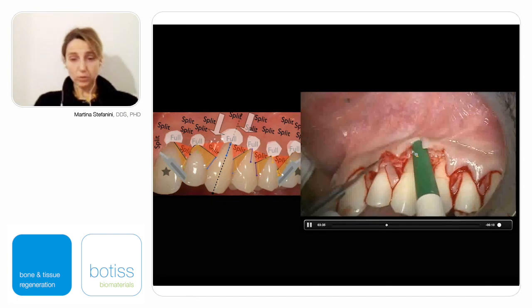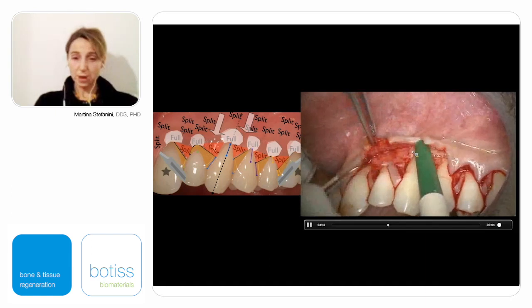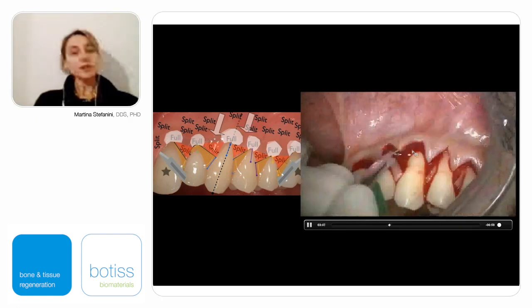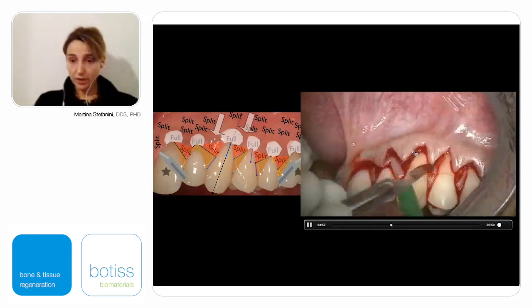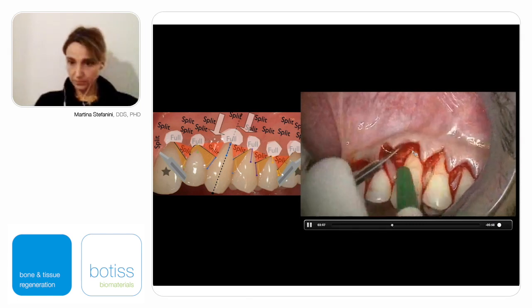This allows, once the muscles are detached from the periosteum, to change the position of the blade that can be maintained parallel to the external surface to detach the muscles from the flap. But we need to first detach the muscles from the periosteum.